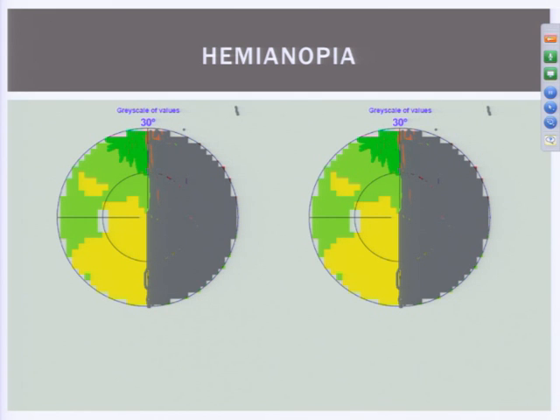The amount we shift depends on how mobile the patient is. Young people with a stroke, we can shift the image over pretty far. Elderly people that have trouble with the fact that the prism shift is a bit disoriented, we have to shift it a little bit or shift it in steps. So this is the primary use for prism in stroke patients, and we use it pretty routinely in people who have a hemianopia, and we test them and do various other techniques as well.